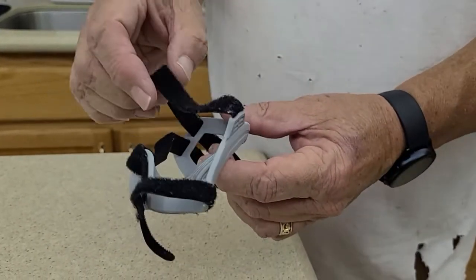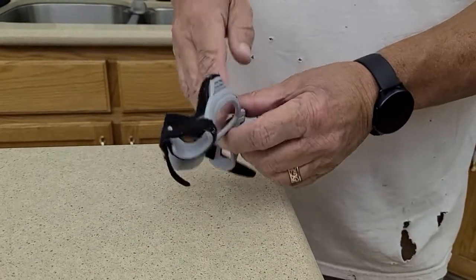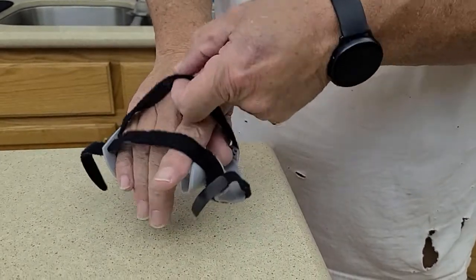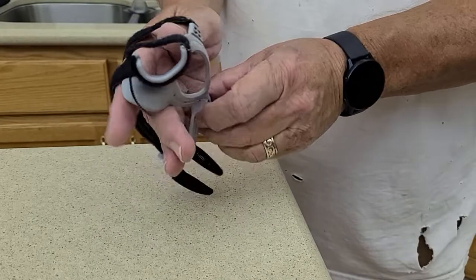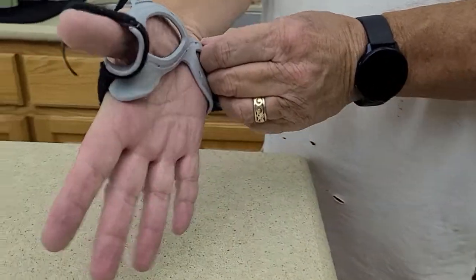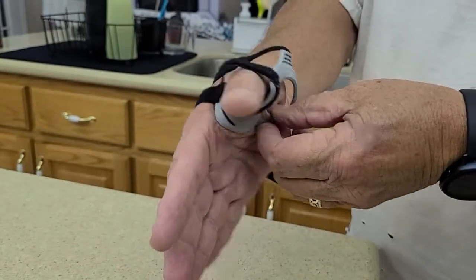All you do, have it loose, have this undone like that, and then you take your hand and put it in here. You pull these over the back of your hand like that, and you pull this all the way down until this part goes up where your thumb meets.